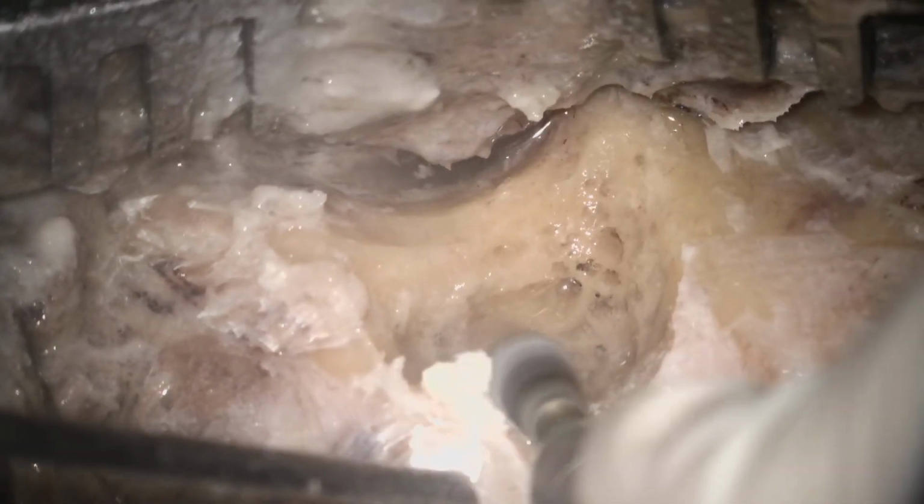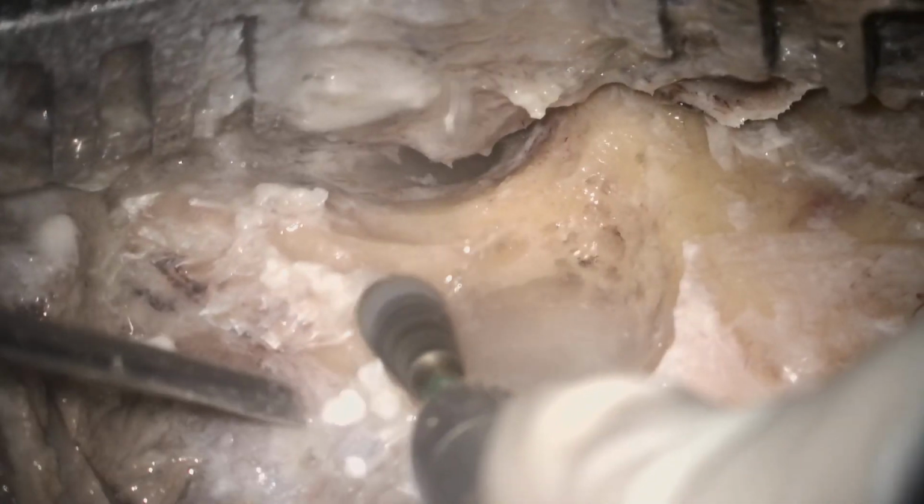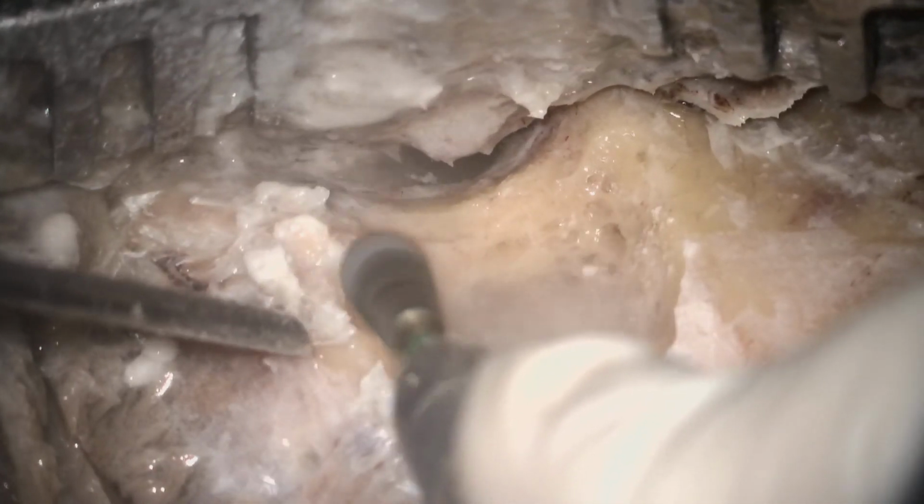So that is very important, because if there is some bone dust, some accumulation, and you are still doing drilling, you can miss some landmark and ultimately land up with a big damage. Okay, so like that you will go.